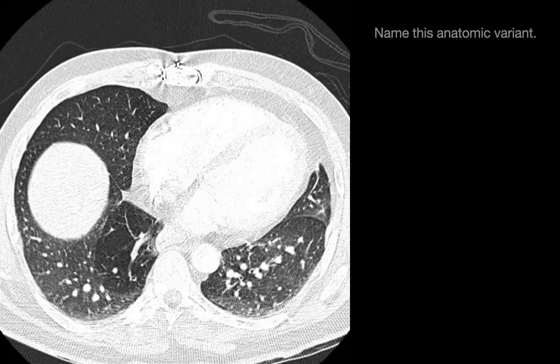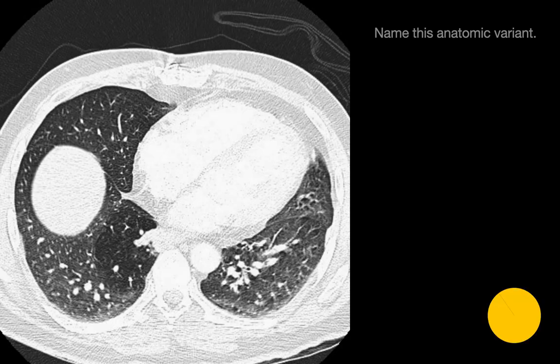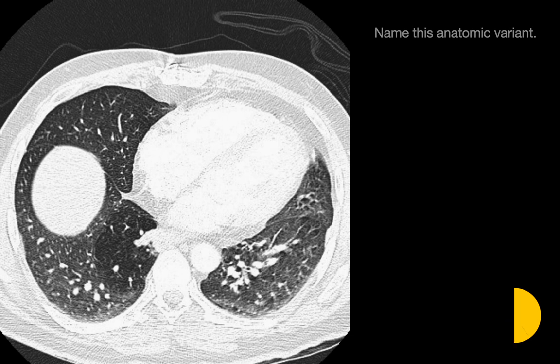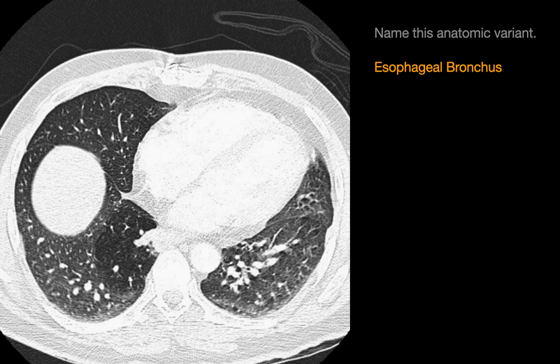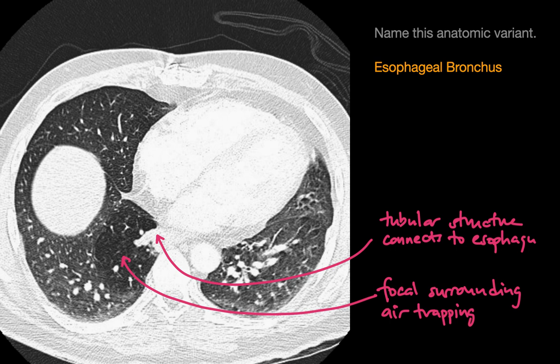The imaging finding here is in the medial right lower lobe. We have a tubular opacity that seems like it's arising from the lower mediastinum, specifically the esophagus, going into the medial right lower lobe. It's associated with a region of blacker-appearing air-trapped lung. This anatomic variant is an esophageal bronchus — a fluid-filled bronchus connecting to the esophagus, with some air-trapping in the associated lung.